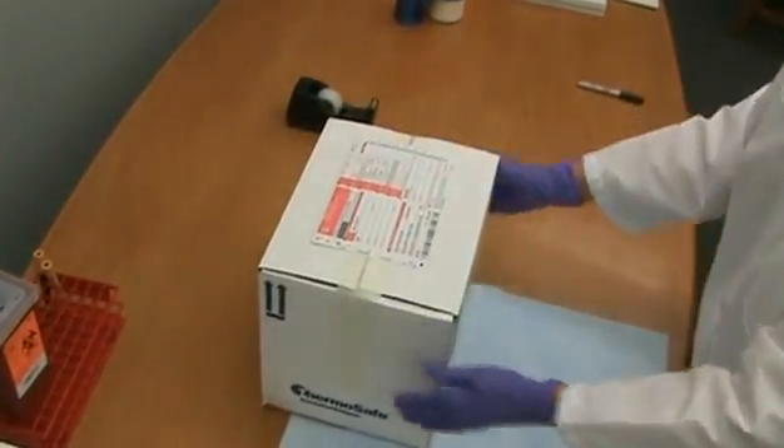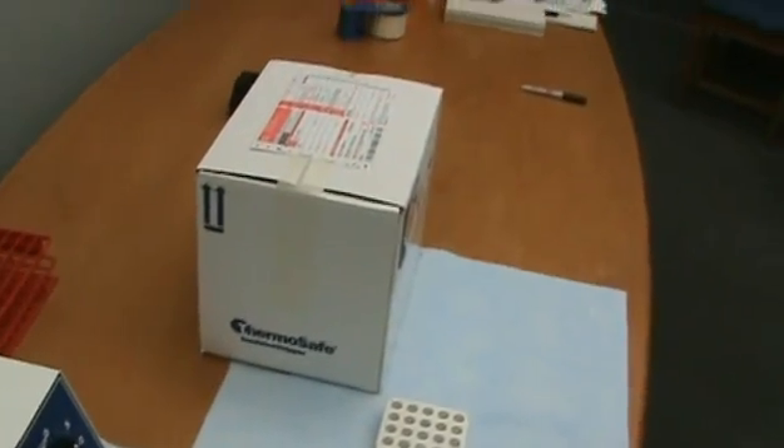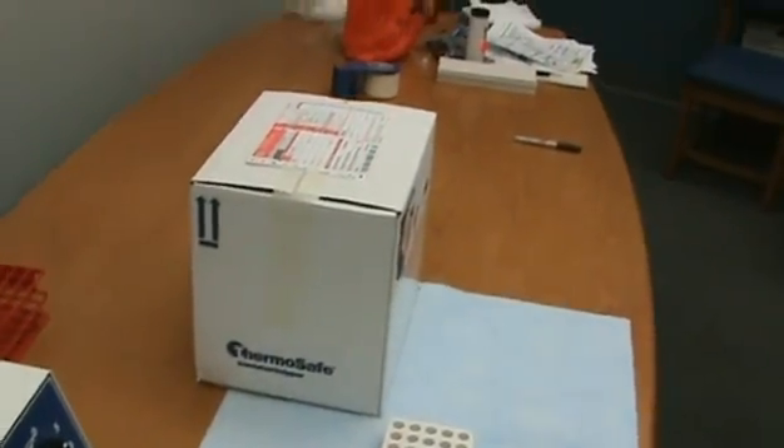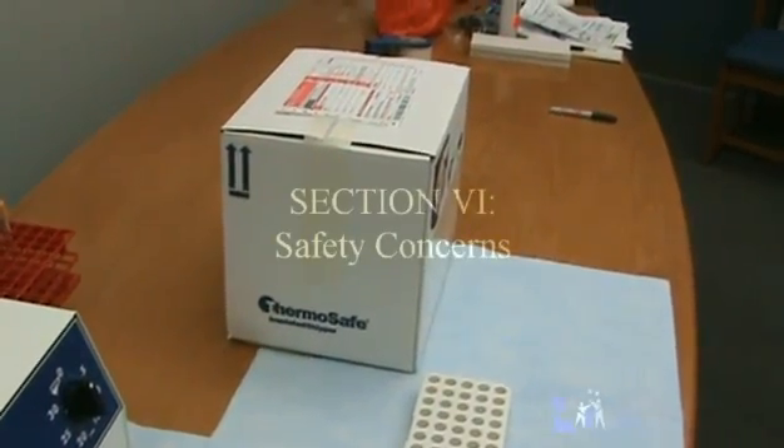Place the provided air bill on top of the box. Ship specimens every day except on Friday, Saturday, Sunday, or the day before a federally observed holiday. Specimens must be shipped cold and received cold within five days of collection.